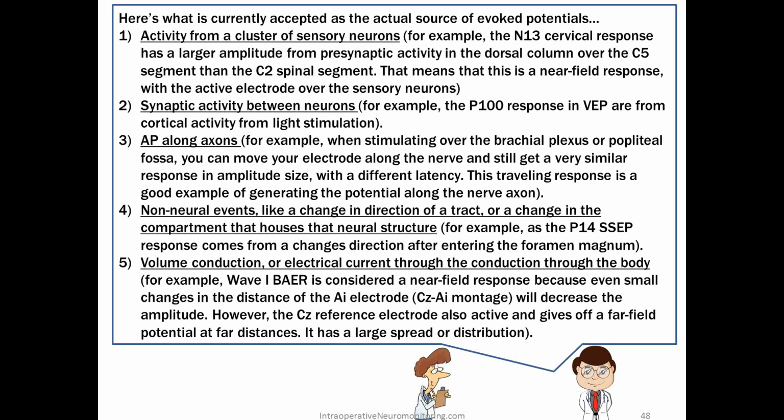For the CNIM, if you ever are asked that question, don't go with what is the reality, go with what's best known. Choose A, wave 1 is a near field response. But in the real world, know that it is a mixture of the two, mostly near field though.